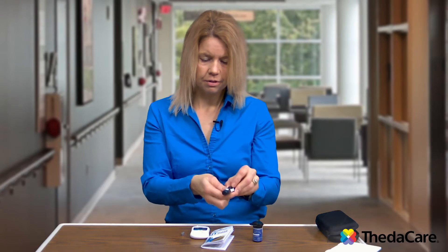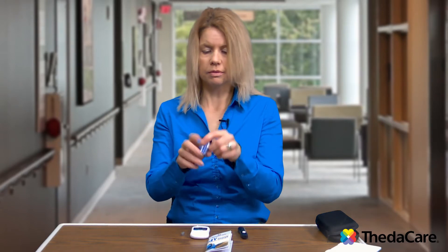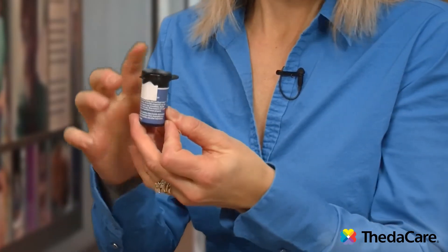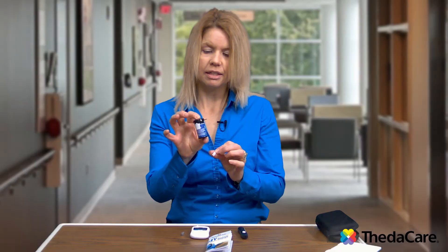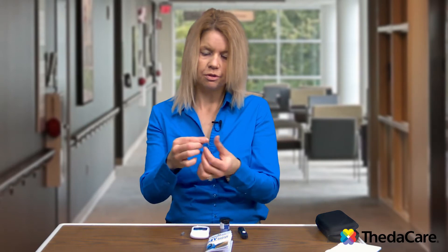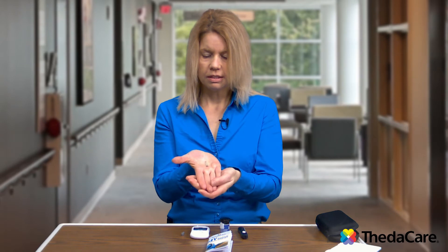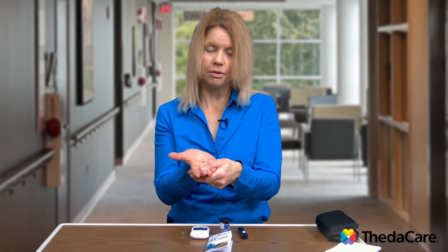Before I demonstrate how to poke your finger, I'm going to show you about the actual test strip. You're going to take your test strip out — test strips always come in these black cylinder containers, and you want to keep them in there to protect them so they don't go bad. They can get damaged with heat and too much light. This is the test strip for this glucose meter.